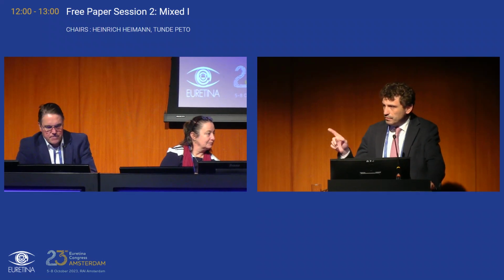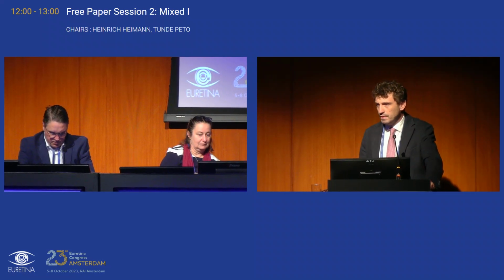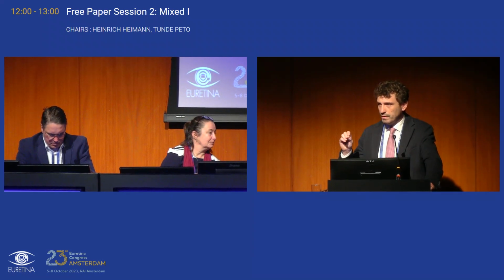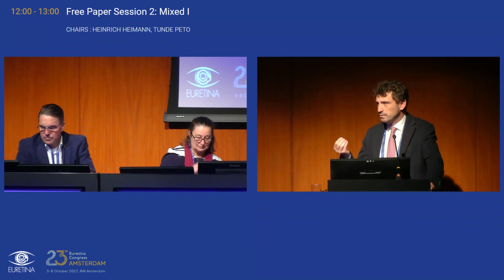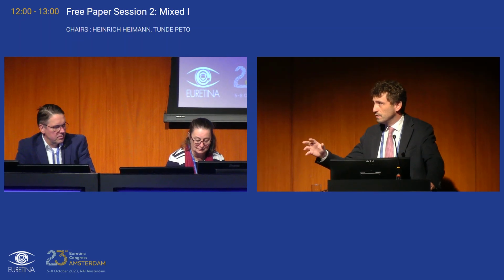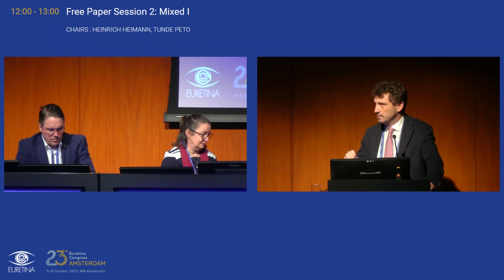We have not looked exactly at these parameters, but we are now starting to do that because it is absolutely interesting, also for the circulation of the big choroidal vessels that are sometimes involved not only by the tumor but by the surgical procedures, and so on. What we focused on is, in a patient without macular involvement by the tumor or the brachytherapy direct irradiation, whether the changes occur first in the choroid or first in the retina. For us this is absolutely important because sometimes we forget that the choroid has a role in this disease. Also thinking about diabetic retinopathy, we know that some drugs do not work in diabetic choroidopathy. And probably we have to change our vision that the retina is not the only actor in the disease, but also the choroid.